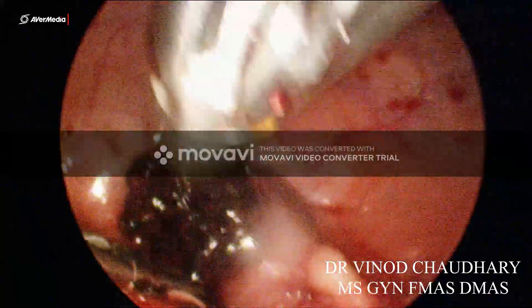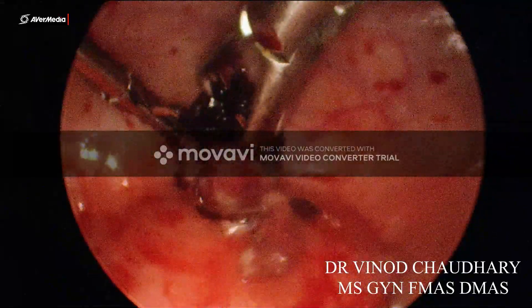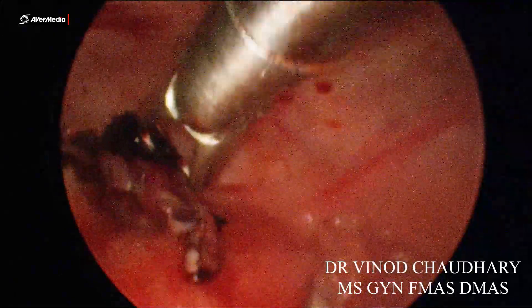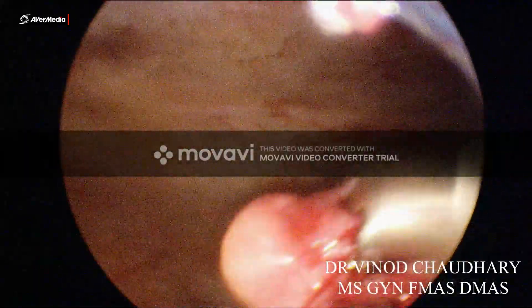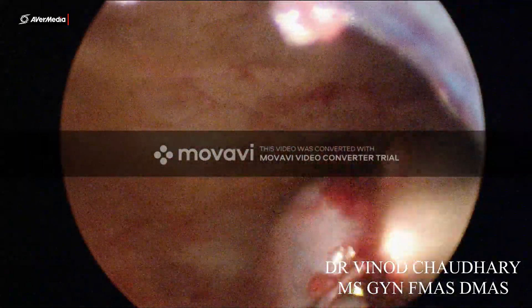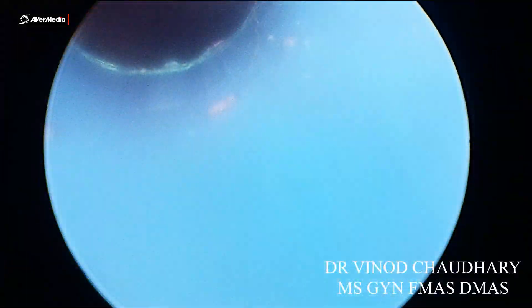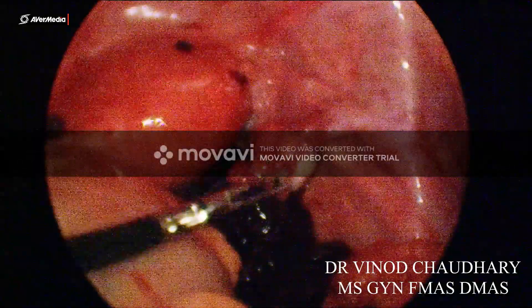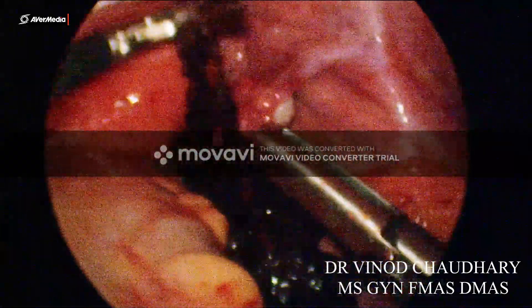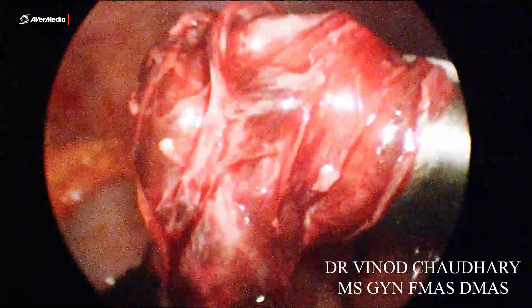Just removing the clots and blood inside the ectopic. Now you can see it is out. We are taking it out — and it is out. Now we are taking out some big clots which we are unable to remove through suction; those parts we are taking out manually.